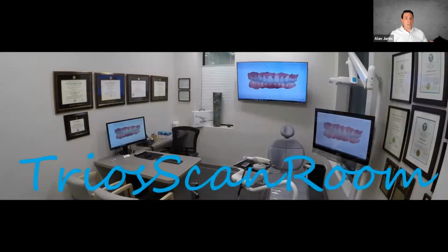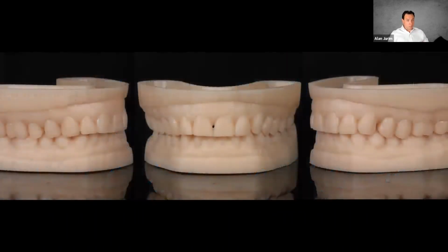So we scan all of our patients every time. All of our new patients come in, they receive scans, and we've built a patient library from that. But fundamentally, as the patients come in, we use the scans in order to help diagnose and to try to tailor a treatment plan based off what the patient's expectations and goals are. This is a set of models that I printed a couple weeks ago, used for a diagnostic consult with the patient. This is the same model, just printed several times.